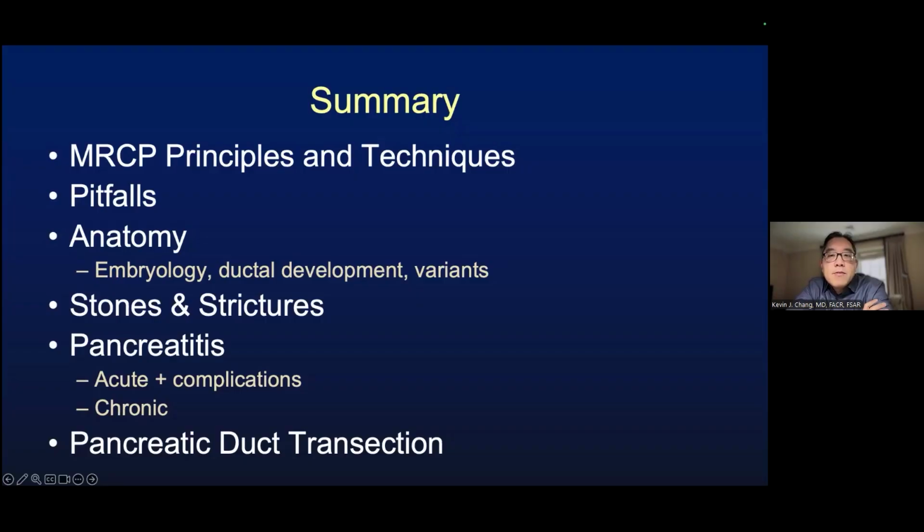But in the absence of that kind of a history, these are the ones where at least one follow-up is warranted because pseudocysts should change over time or resolve in most cases, whereas an IPMN will persist or maybe slowly enlarge. So yes, both can communicate with the duct.